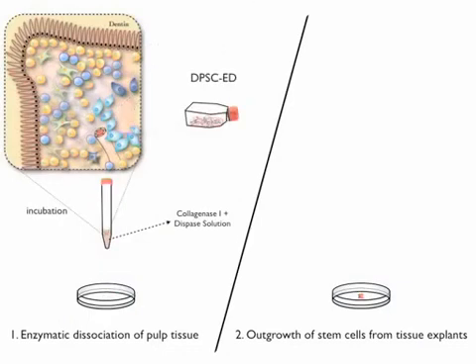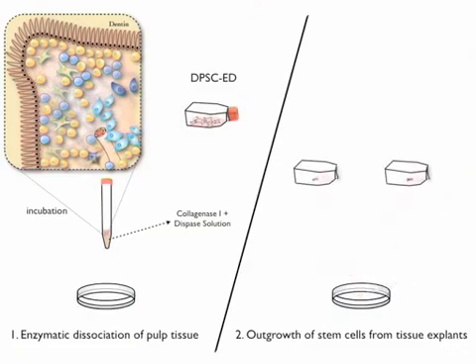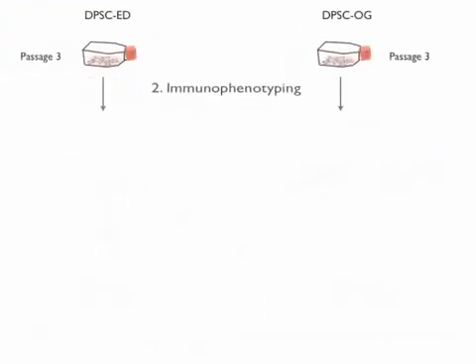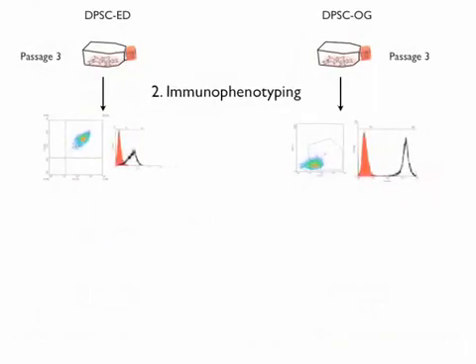In the second method, pulp tissues are only placed into the flask without any digestion. In this way, DPSCs begin to migrate from the tissue into the flask. These cells are named OG, referring to the outgrowth isolation method.